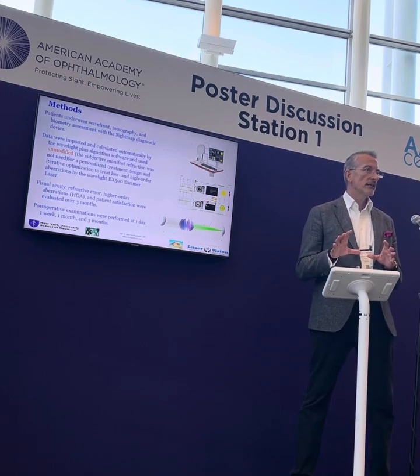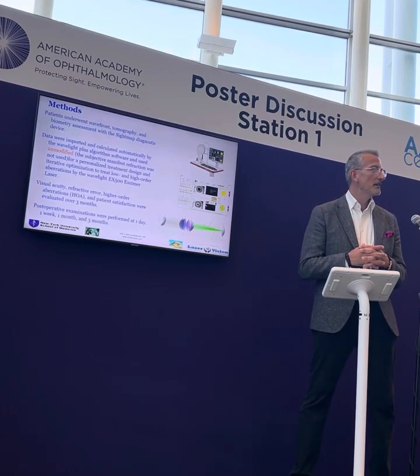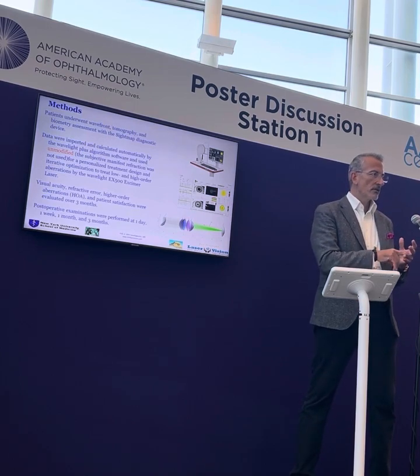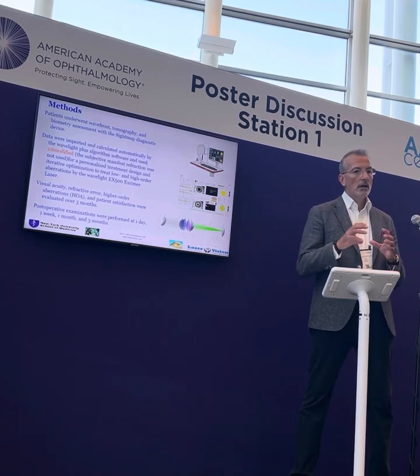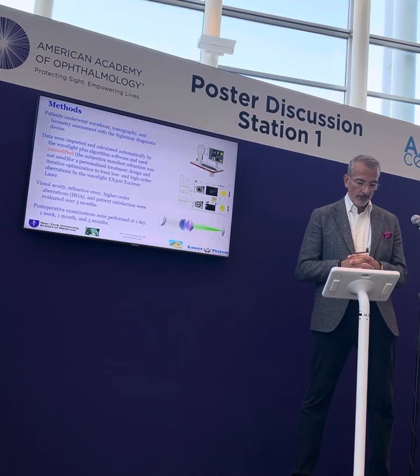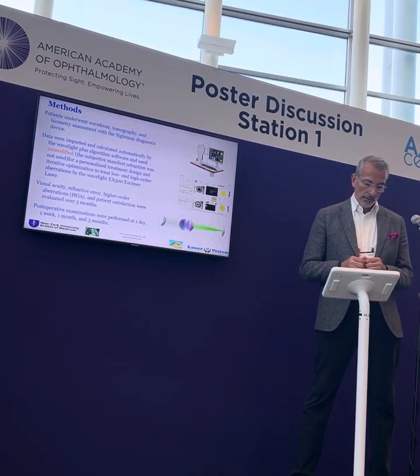So whatever the device spit out, and excuse my French here, as the treatment as far as lower aberrations, myopia and astigmatism, higher aberrations, were actually set by the device, stepped on the pedal, delivered on the cornea. And this is new for laser refractive surgery, at least for me.